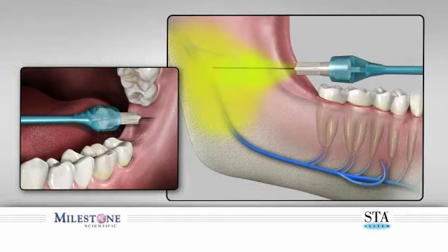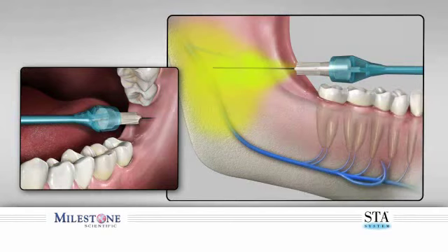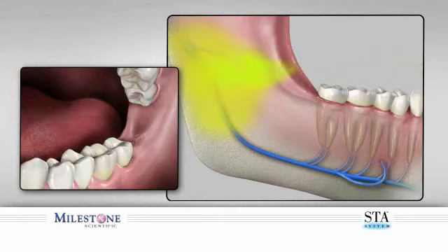To avoid anesthetic solution sprayback into the patient's mouth, perform the following. While the needle is still embedded in the patient's tissues, depress and release the foot control pedal. Count 3 beeps after releasing the foot control, then totally remove the needle from within the patient's mouth. Direct the needle away from the patient as a small amount of anesthetic solution may still be present. Should you require more than 1 anesthetic cartridge, you can reload subsequent cartridges and continue as required. Please see the section on multi-cartridge technique.